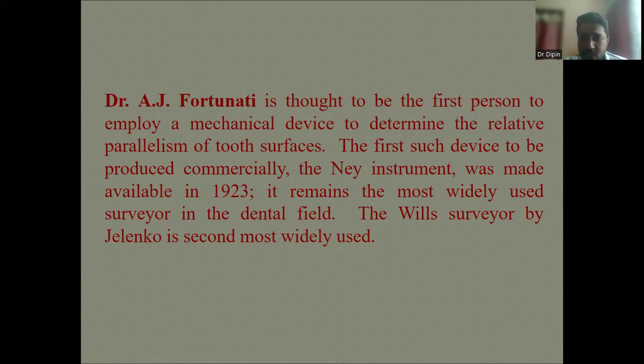And since these are the two main classes, we have very different features. The main differences are there between these two surveyors, where in one the analyzing arm is suspended, and in the other it is spring loaded. So some major differences are there between these two surveyors.